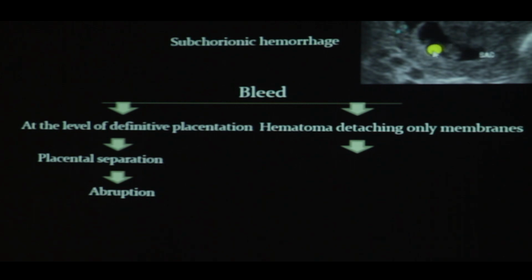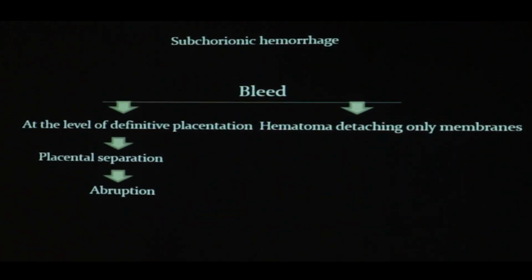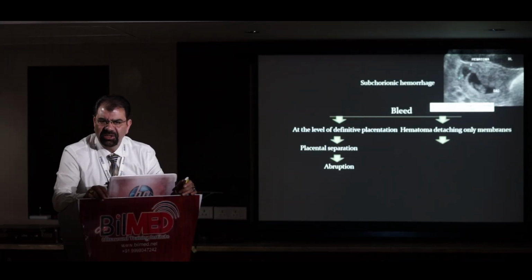Now this is a small gestational sac over here, and this small gestational sac is having the decidual reaction around it. This is the decidual reaction. And I am seeing a hazy decidual reaction at this point. But the point is, am I seeing a thick decidual reaction at this point and thin here? Yes, I saw a thick decidual reaction.